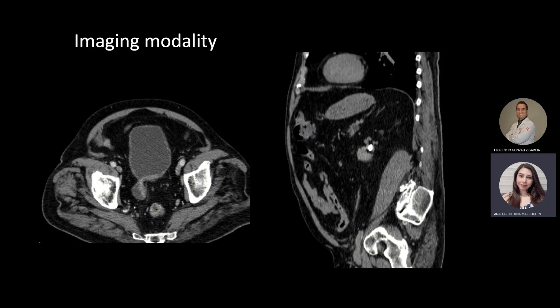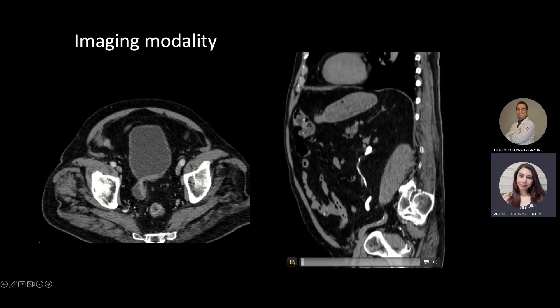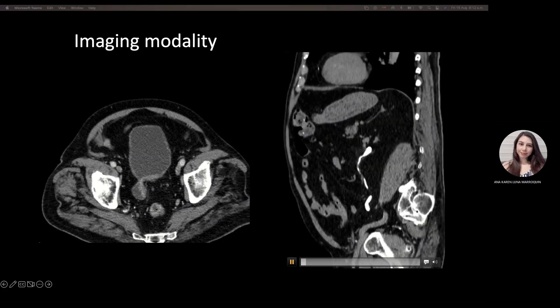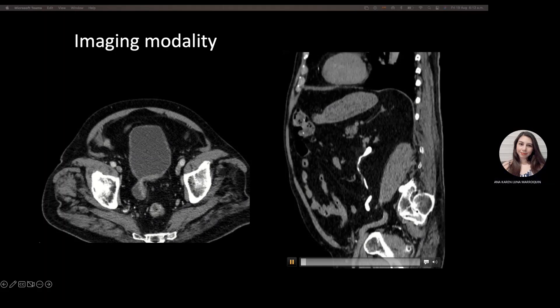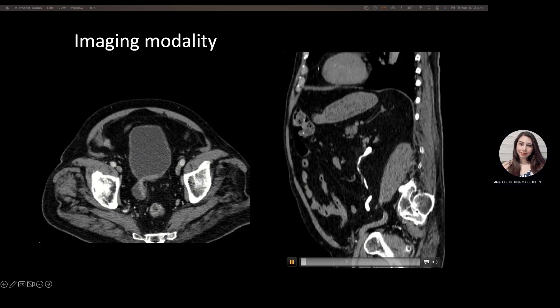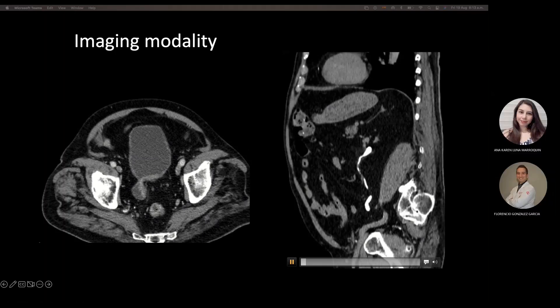Other findings included an enlarged prostate. Excretory phase showed a filling defect in the bladder wall, inner of the diverticulum, and reduction in ureteral caliber, but no gross extension into the perivesical fat, lymphadenopathy, or distant metastasis.